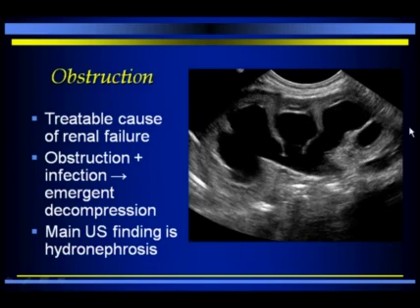So here we see a kidney seen in long axis, and here's the collecting system, and it all hooks up into the renal pelvis. So this is pelvis, upper pole calyx, mid-portion calyx, and lower pole calyx, and notice that they're all distended, they're very dilated. A normal calyx should be cupped so that it has sharp points at the tips of the cups, but this is sort of a clubbed calyx, so this is marked hydronephrosis. And we know these are calyces because they all connect to the renal pelvis.